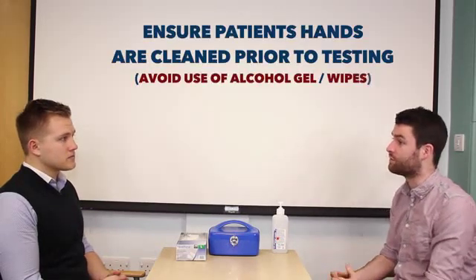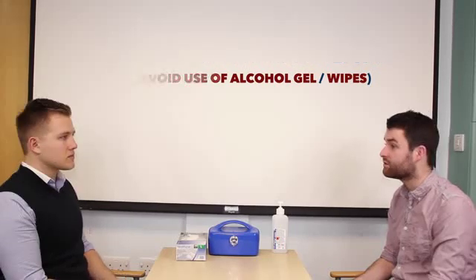Yeah, that's fine. And can I just ask you to go and wash your hands quickly with some soap and water please? Okay. Whilst you wash your hands, I'll just assemble my equipment.